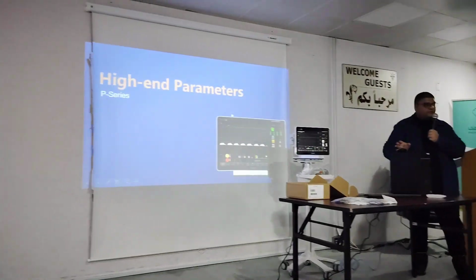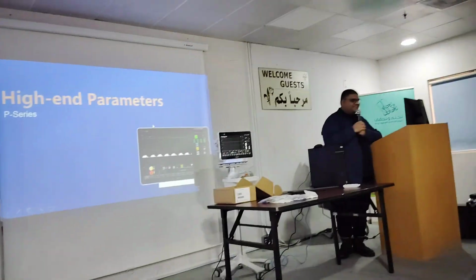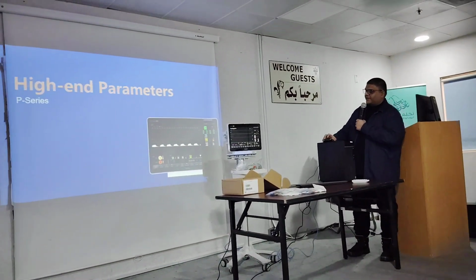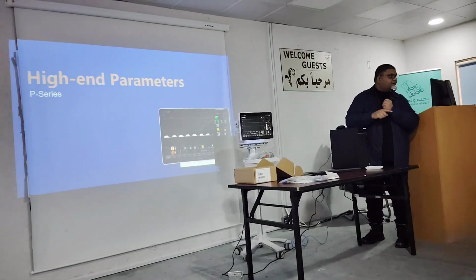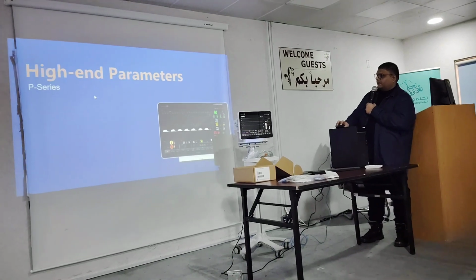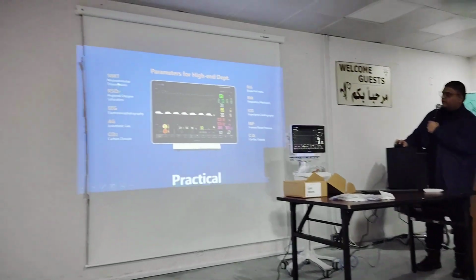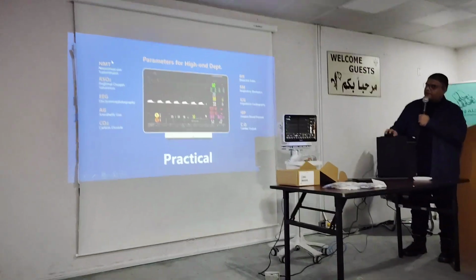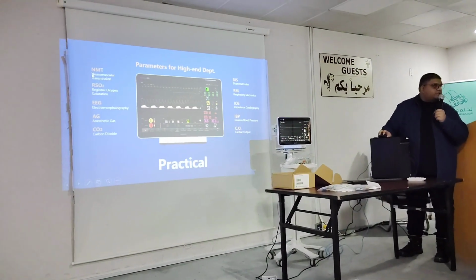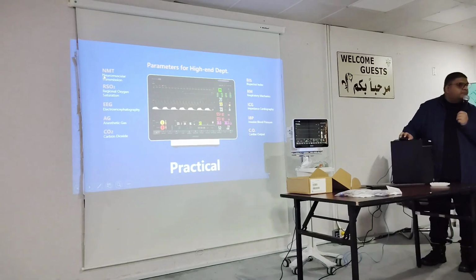All right. So I think we have resolved some issues here. Good. Okay, now let's take a look at some of the high-end parameters. If you have used this parameter, do let me know, okay? If you know what this is. So let's go over here. Here we can see that the high-end parameters of our device include neuromuscular transmission monitoring. Does anybody know what this is?